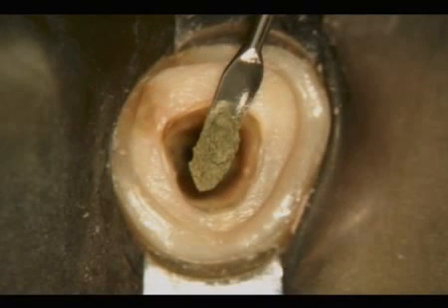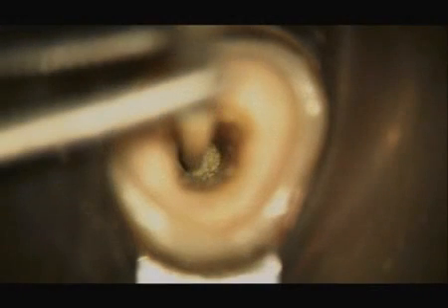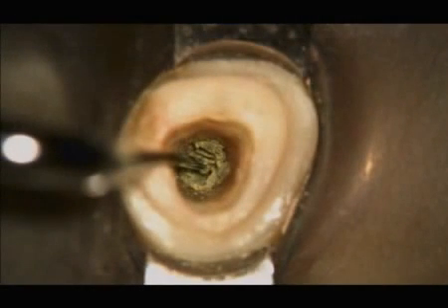MTA is introduced, this time on the side of a West Perf repair instrument, then tamped into the apical 1/3 with a gutta percha cone used as a flexible plugger. We can use direct or indirect ultrasonics to deliver MTA precisely to place, and in this instance, we see the Endo 5 vibrating the material densely into the apical 1/3.